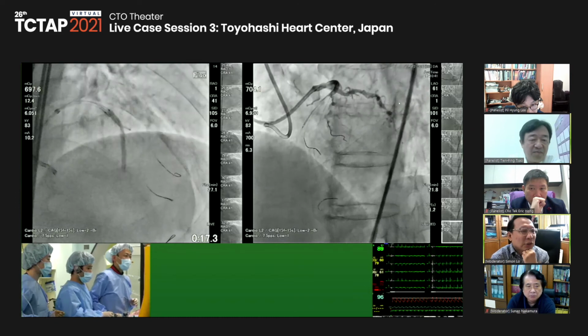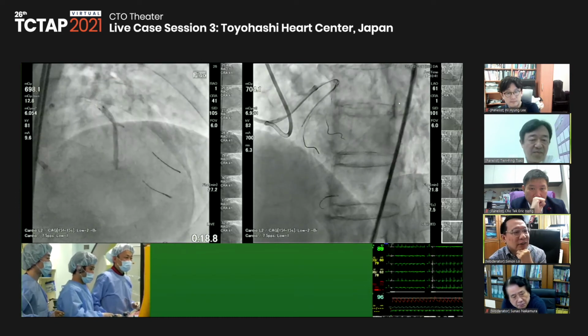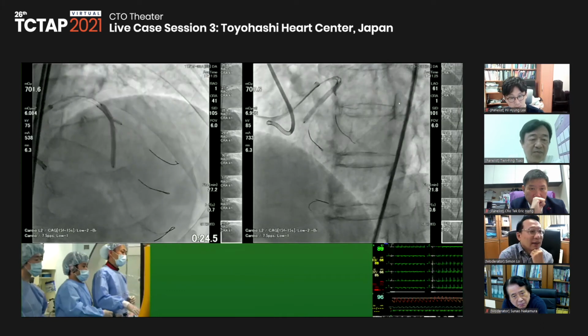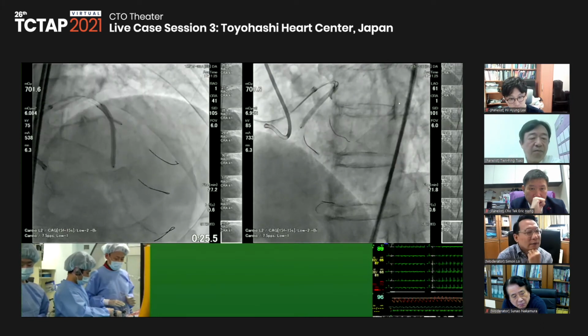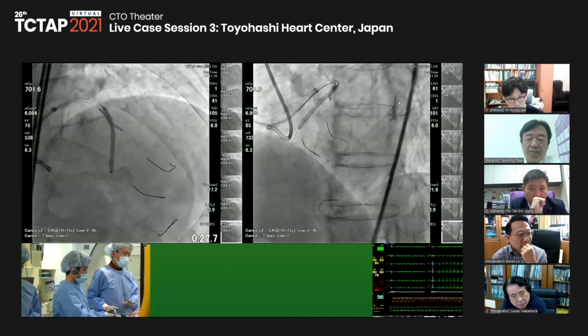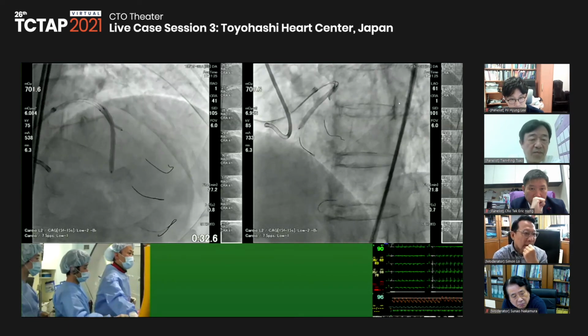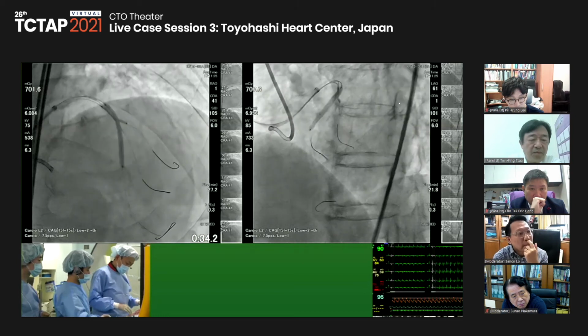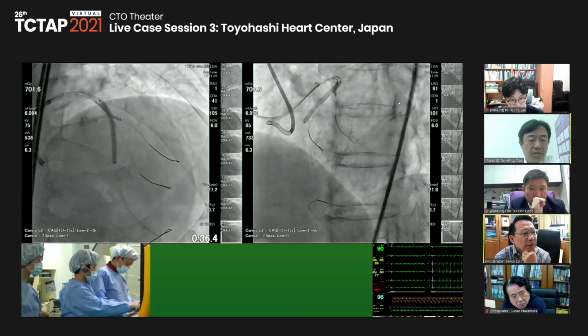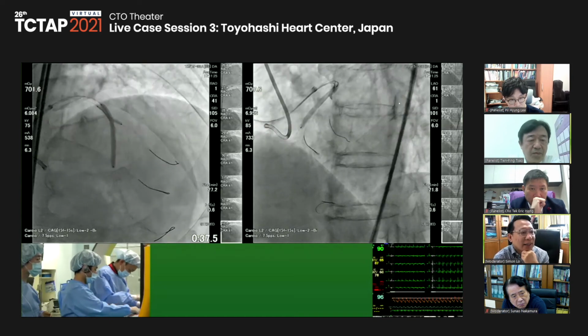Okay. So would you dilate to nominal pressure first? Yes. The distal is very shrinking, so we dilated very slowly and gently. Anyway, the stent balloon is dilated. This is interesting because you dilated both just to protect the diagonal, yeah?